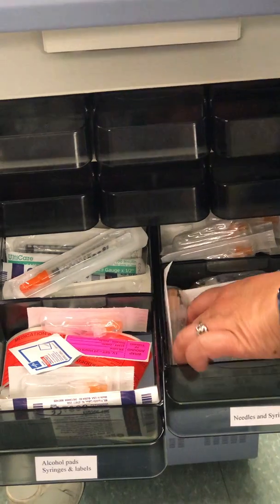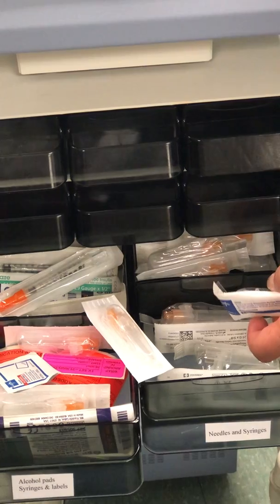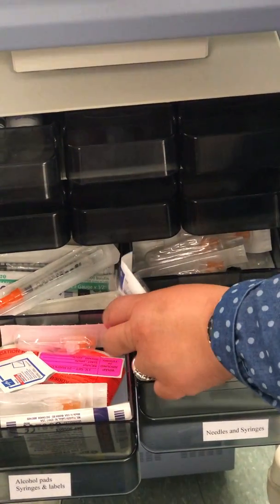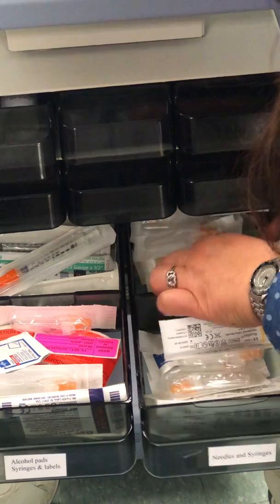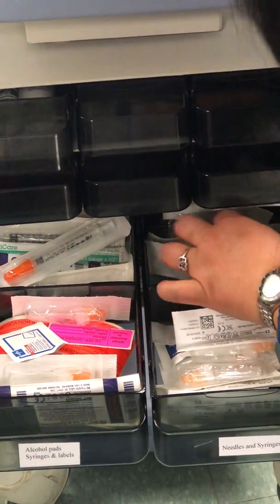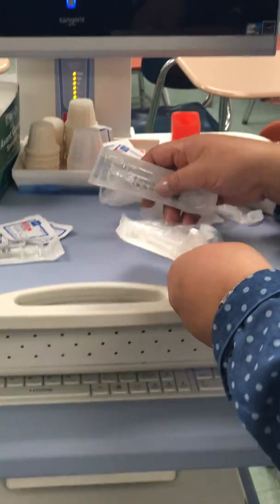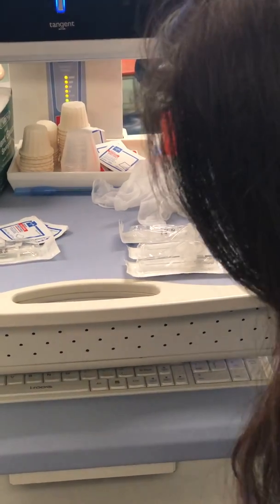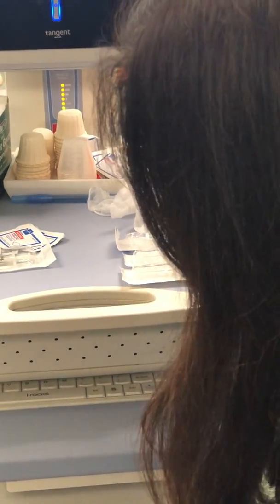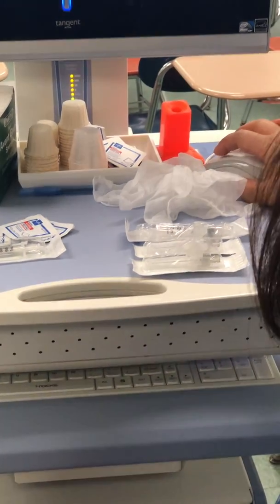So for IM, you can grab, let's open also the patient's drawer, because it might close. You see it's counting down, all right? IM is 22 gauge. And we need 2 of the IM needles, all right? So this is for IM, 3 cc and 22 gauge by 1.5 inch. All right, so close this. Oh, we don't have to close it. And then we can close this now.